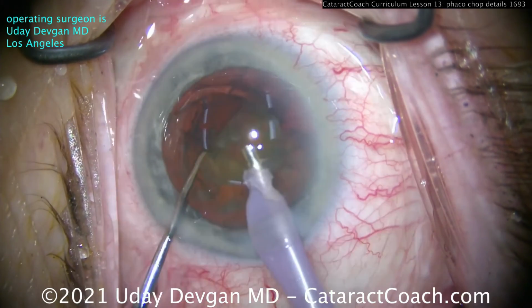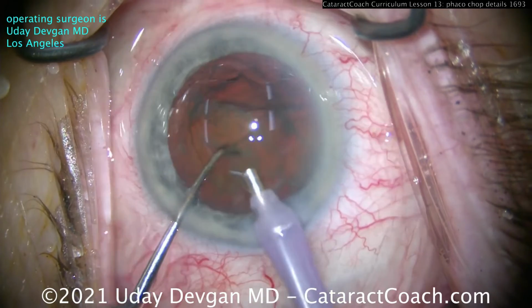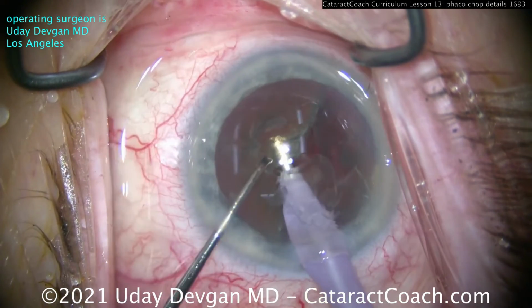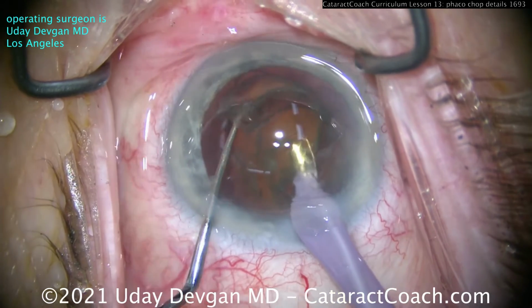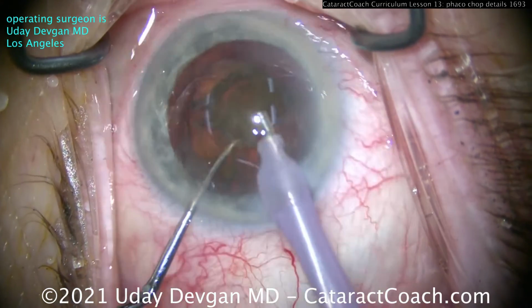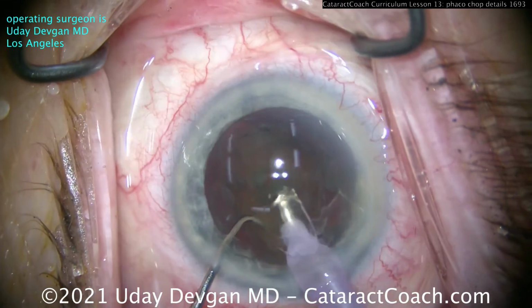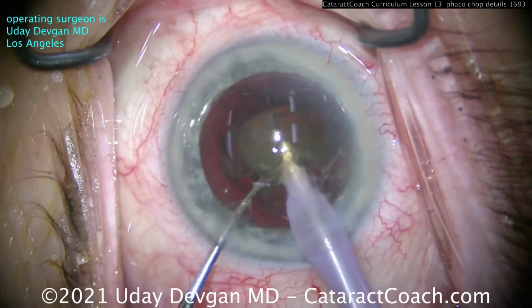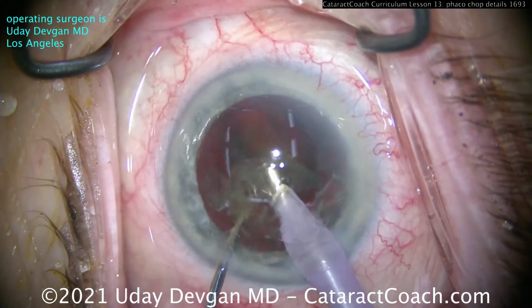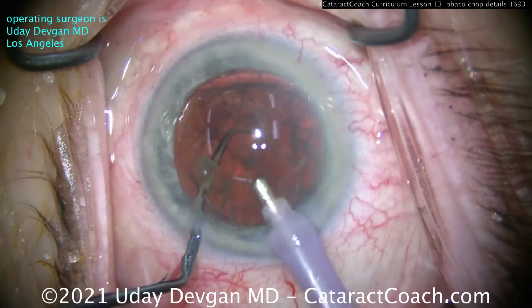And so we can very easily chop this nucleus that has moderate nuclear density. Very easy to chop. And we can do that while keeping both instruments, the phaco probe and the chopper, within the capsulorhexis. Now here at the end, we can bring it up. This is more of the horizontal technique, going around the lens equator. But that initial chop, and even the subsequent first quadrant chop, were done by just placing the chopper into the nucleus, within the capsulorhexis. No need to go under the rhexis edge. And it works very efficiently. You can see the nucleus can be removed in a minute or so.